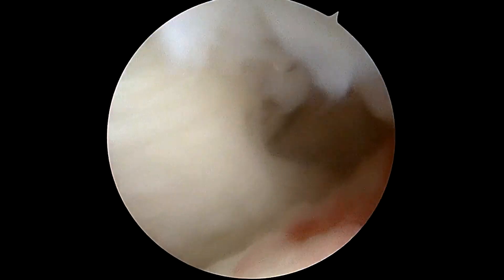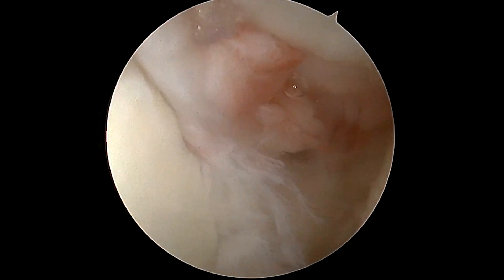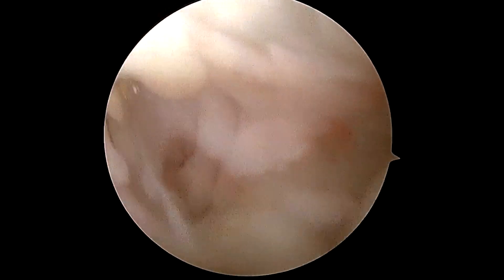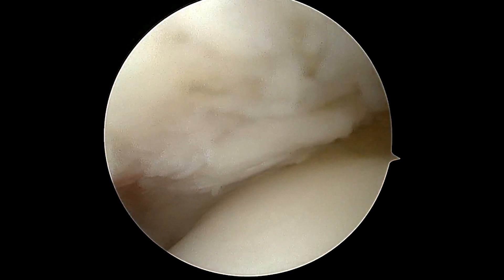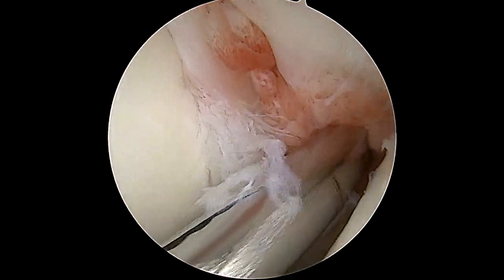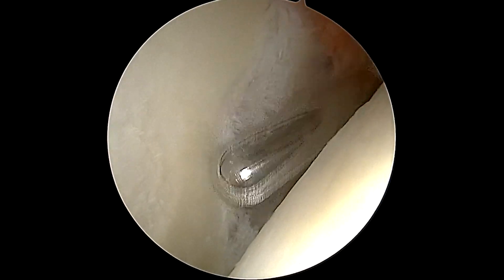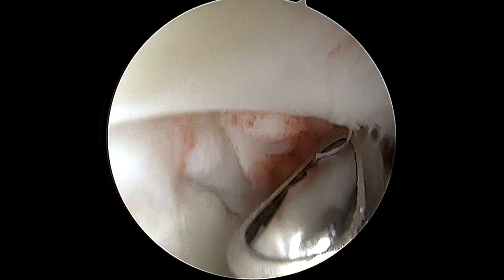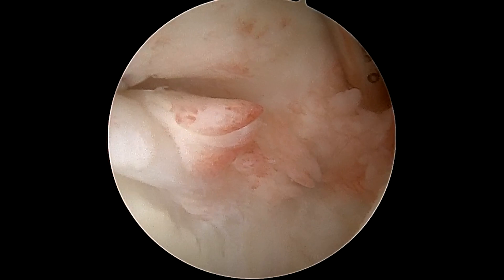Here we're performing our diagnostic arthroscopy. The camera is inserted from the back of the shoulder looking forward — we're looking at the glenohumeral joint. This particular area is looking at the subscapularis, which is the rotator cuff tendon in the front of the shoulder. We're looking more towards the rotator cuff tear up on the top right of the screen, and that just shows the full thickness tear. We insert a shaving instrument from the front part of the shoulder and debride any unhealthy, partially torn, degenerative, non-viable tissue that could cause pain or dysfunction later on.